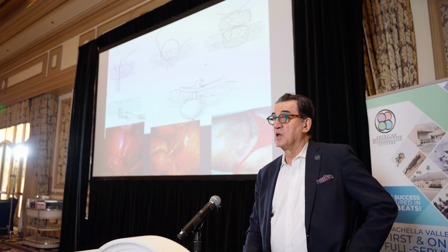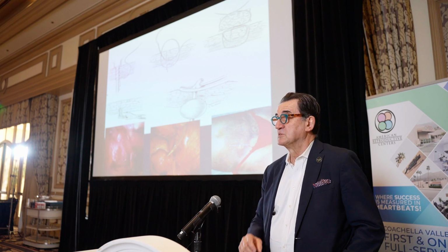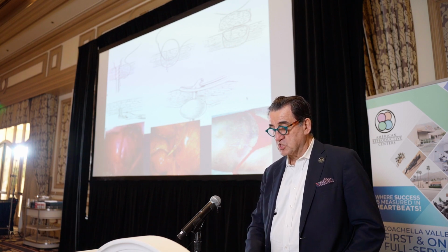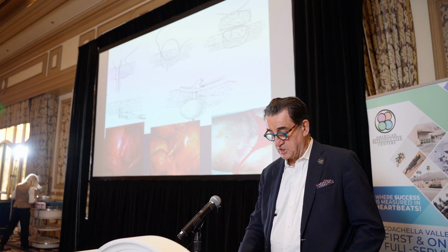And then nowadays you can use suture passers like the Carter-Thomason, and you put it underneath and above. So you tie it underneath and above, like in this situation here, and you just cut it the next day. They may have huge hematomas, but they should be fine.